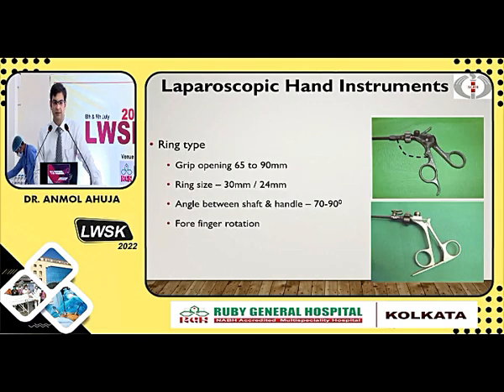And next is laparoscopic hand instruments. Most of these instruments, if you buy them from a good company, are very ergonomically made. That is why they are so expensive. A lot of research goes into making these instruments. If you compare them with very local instruments, you will find a difference between the ergonomics of the two and the comfort of using them.